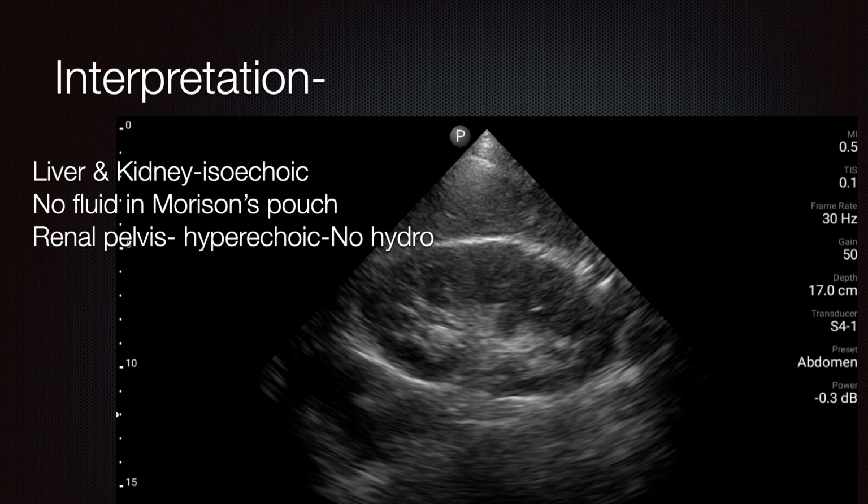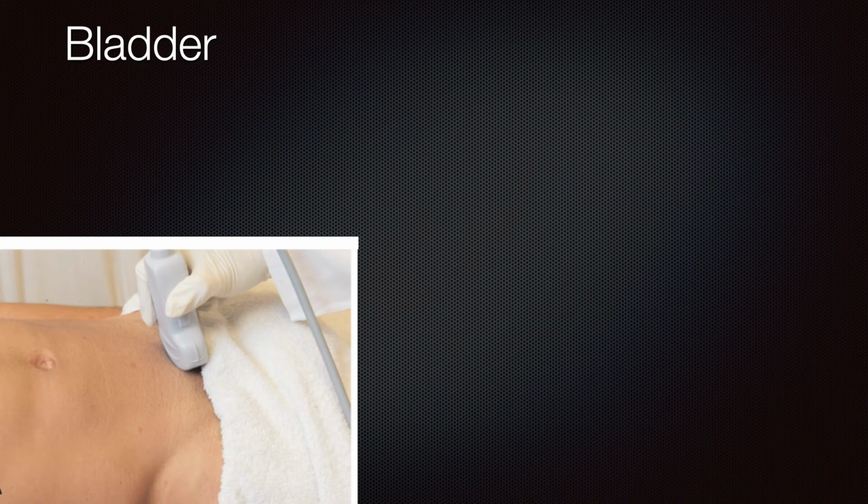Then the renal pelvis, make sure that it's all hyperechoic. Again, if there are hypoechoic areas, put color Doppler there to just see if there are renal veins, which is really common. But this is hyperechoic here, so there's no evidence of any obstruction. And then finally, you can measure the kidney to see if it's normal size. Normal being 9 to 12 centimeters in that view.